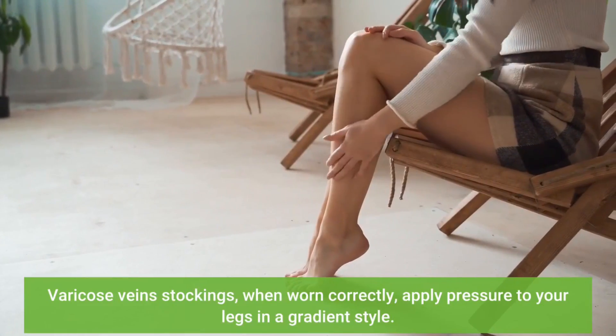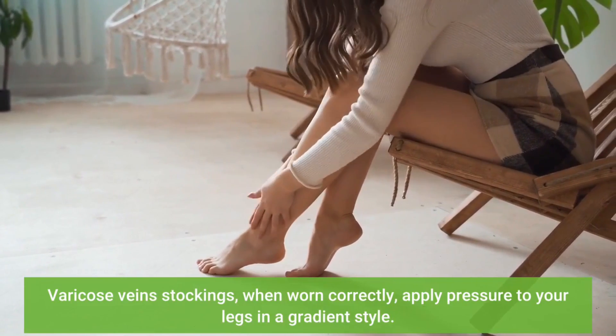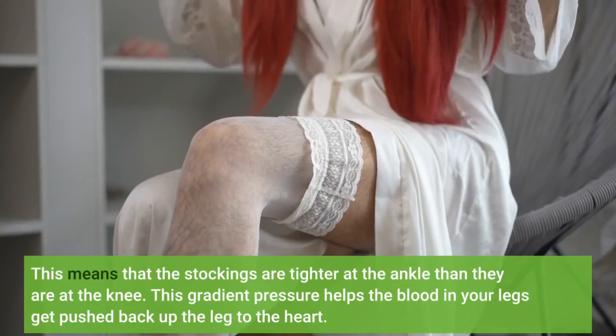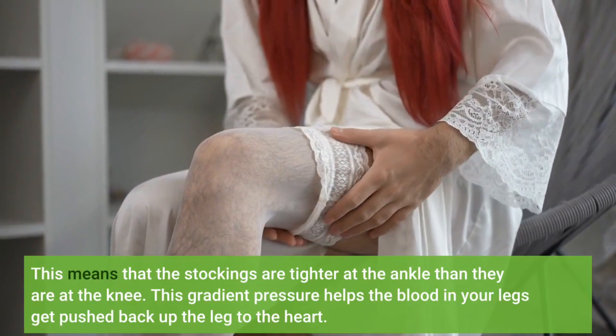Varicose vein stockings, when worn correctly, apply pressure to your legs in a gradient style. This means that the stockings are tighter at the ankle than they are at the knee. This gradient pressure helps the blood in your legs get pushed back up the leg to the heart.